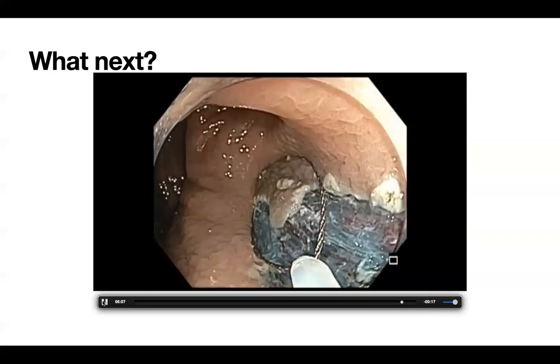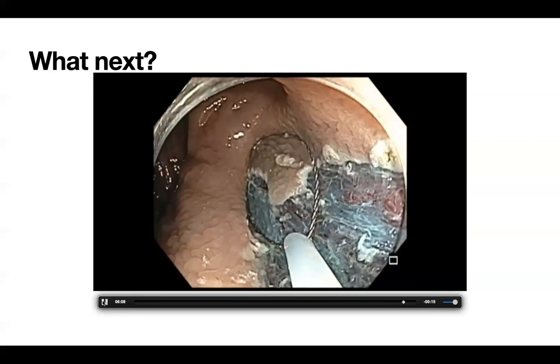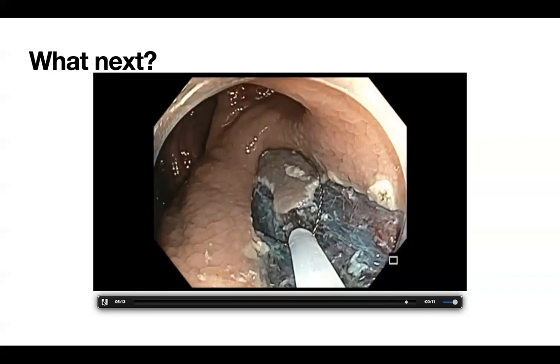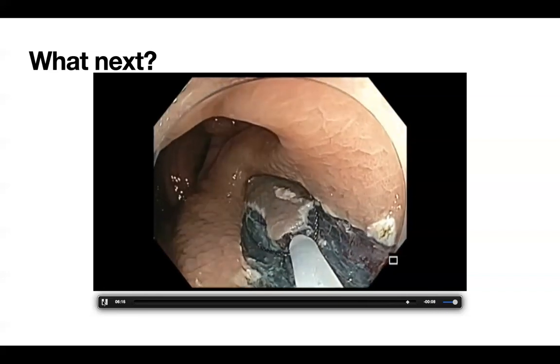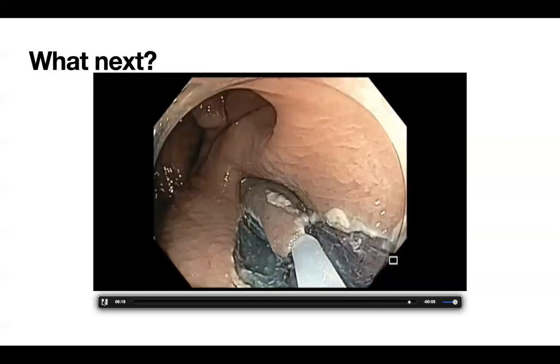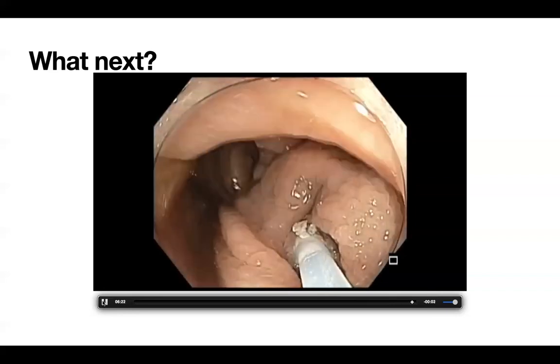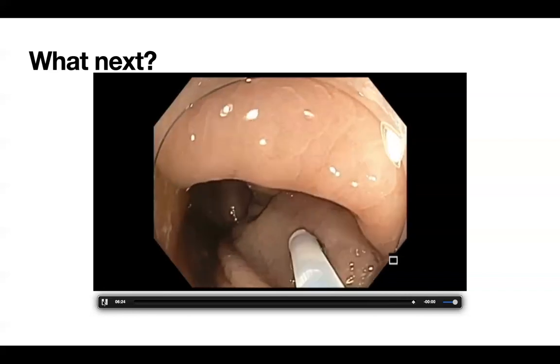Right. I think, Sriram, you make a very good point. And I was actually debating myself what to do. And when I saw the lesion, I said to myself, if I cut, I better cut completely so that I don't have a pathology that surprises me later on and then have to go back and deal with a lesion that has been scarred down.